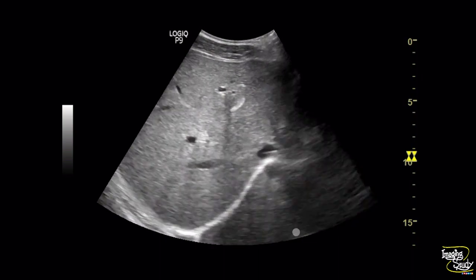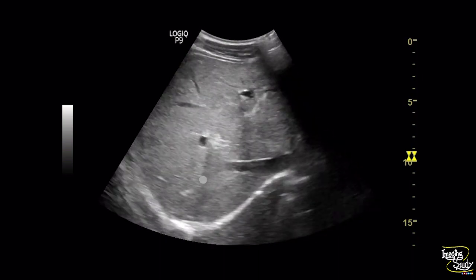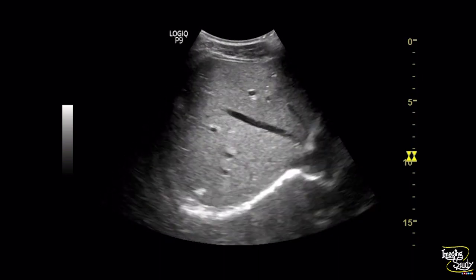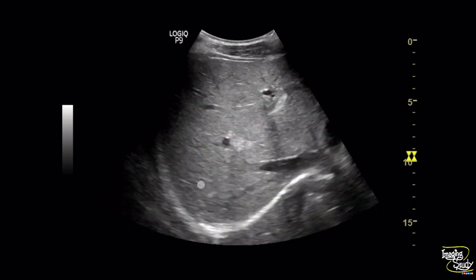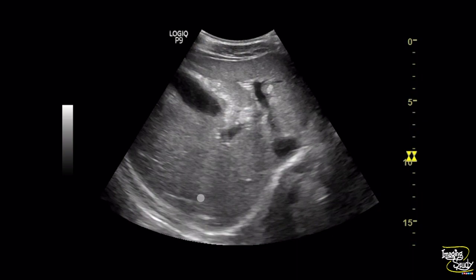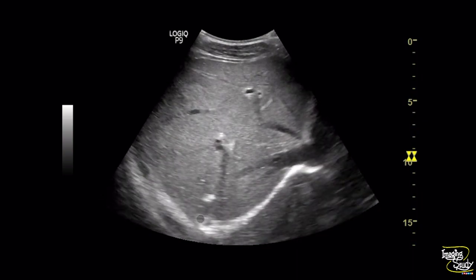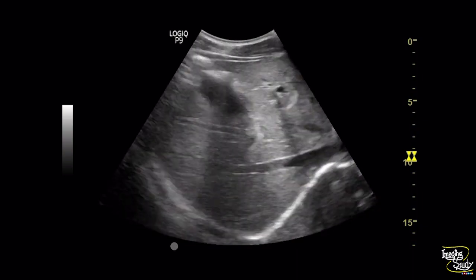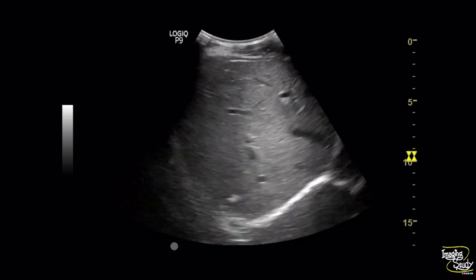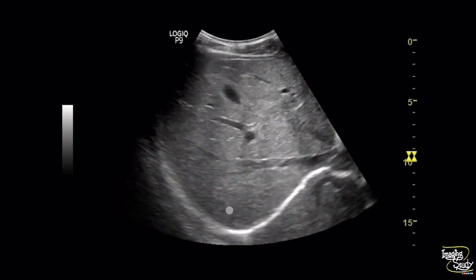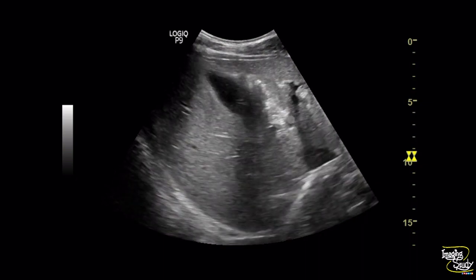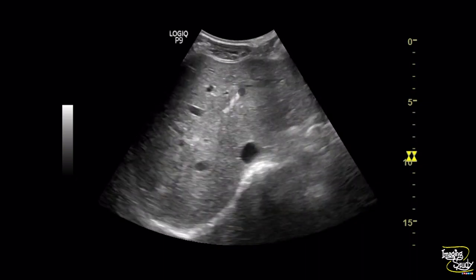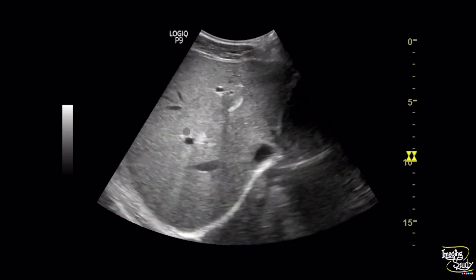On ultrasound, you can see tiny hyperechoic foci at segment 7 of the liver indicating hepatic calcification — that may initially confuse you. But you can also see there is another hyperechoic linear lesion, and we want to focus on that part.